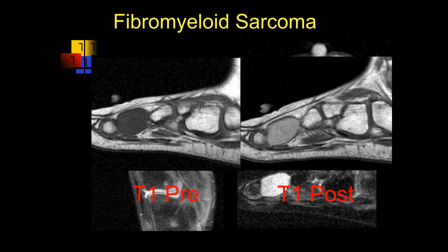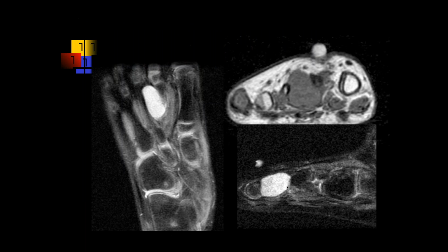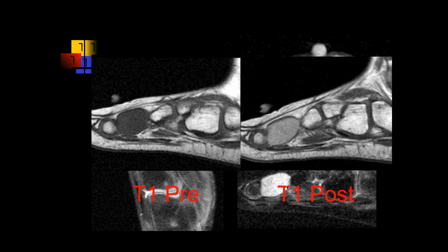So, you know, you kind of might think on the benign side, but when it comes to soft tissue masses like this, you just can't clearly differentiate. So I think you have to be concerned about all of these. Morton's neuroma would be a differential for this case, or is it too big for Morton's neuroma? Too big. I don't think you could ever get one that size.